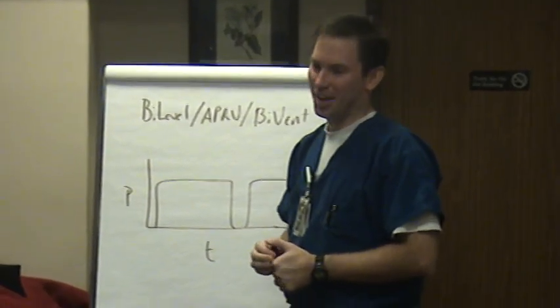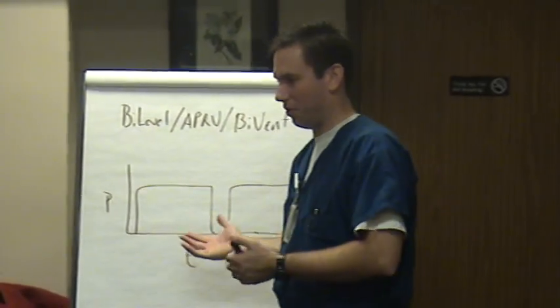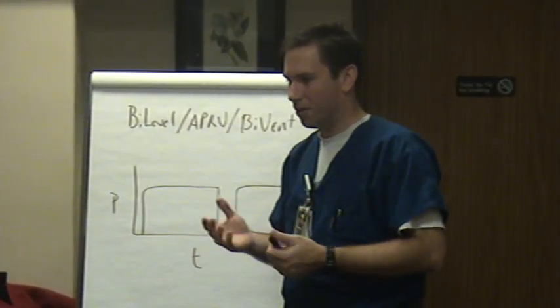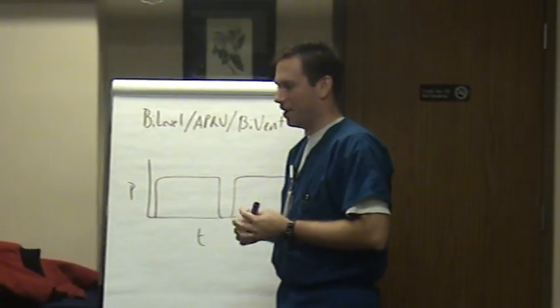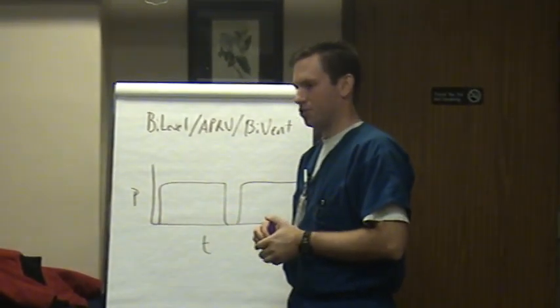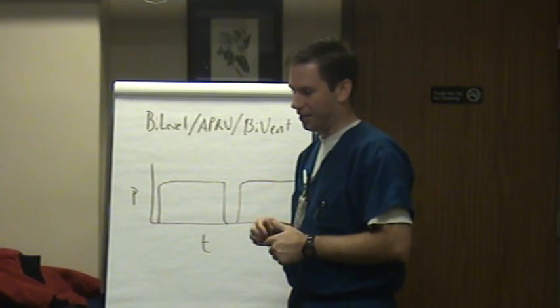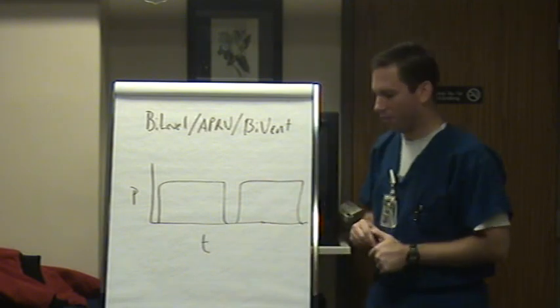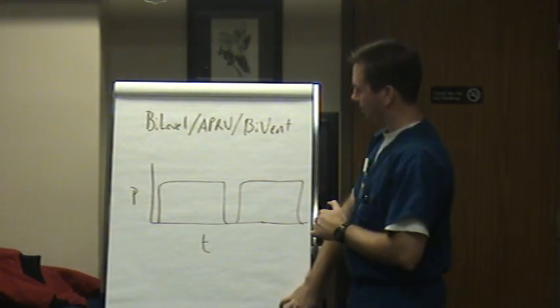So y'all have a fun job with us, thinking, okay, we want to open the lung. Ryan, open the lung. Ryan, open the lung. Next thing you know, we herniate. It didn't do any good that we opened the lung because he doesn't know anymore. And so that is the challenge in trauma, is to say, okay, this mean airway pressure and this mechanical ventilator does a lot more than just breathe for us. It does affect a lot of other parameters. So keep that in mind.